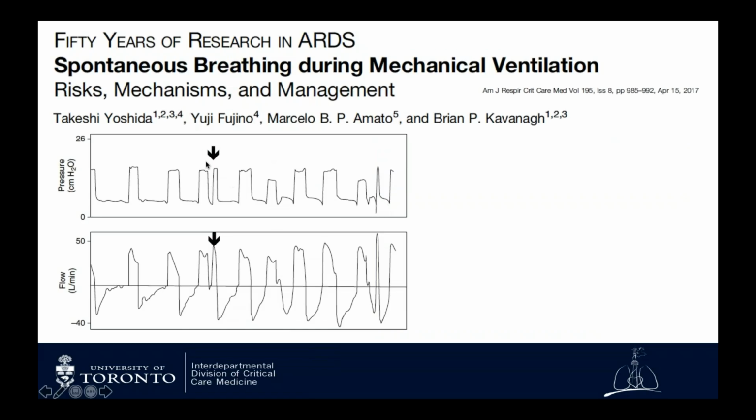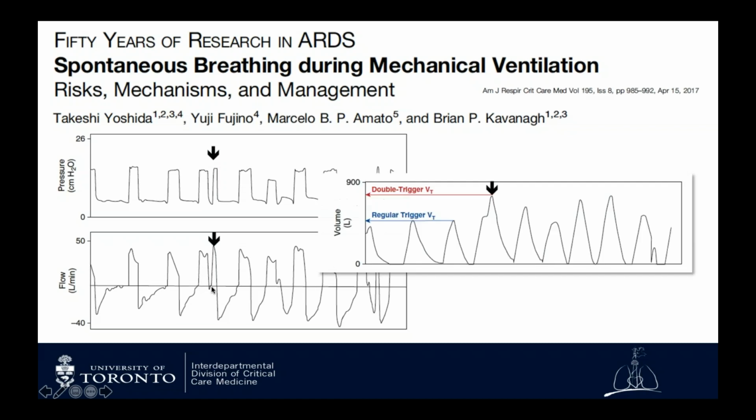Just to point out that this is the double triggering that we can sometimes see if patients are making large efforts and are still trying to take a breath in after we've cycled to expiration. In this particular example here, this is shown as a larger tidal volume. In some ventilators, actually, you have to look at these tracings because the ventilator might count this as a second breath and say, oh, as soon as flow went to 0 here, that was the end of this breath, and this is a new breath, even though the patient actually hasn't had a chance to breathe out.